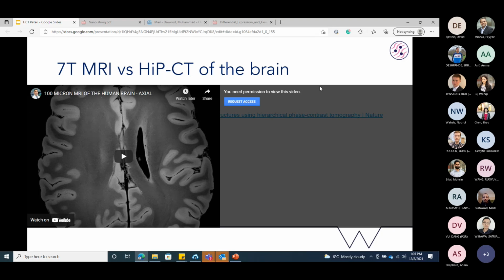But this is the first time anyone has used an MRI or any CT for showing cells, right? Yeah, exactly. And just to give you some background, the MRI on the left was a 7 Tesla MRI scanner scan of a dead person, but that scan took 100 hours. To get such high resolution, it takes a long time. 100 hours? Yeah, 100 hours. What happened to the patient? I'm not sure, but they weren't alive at the time.